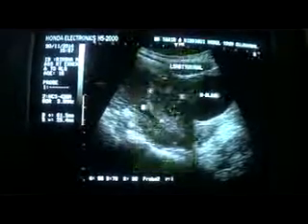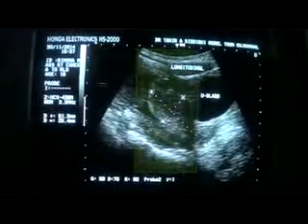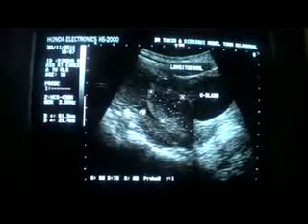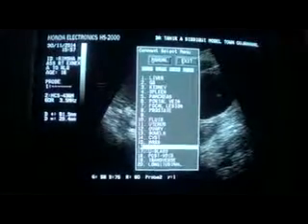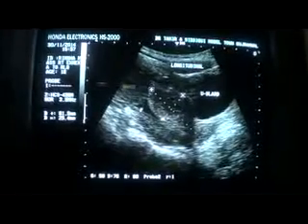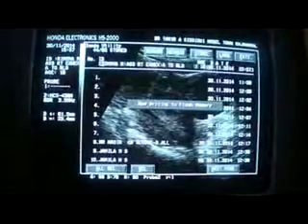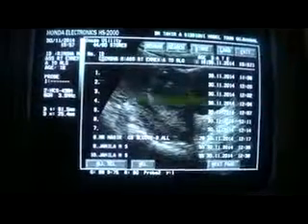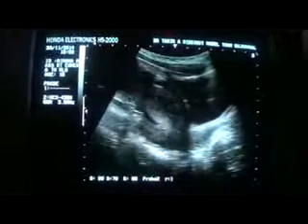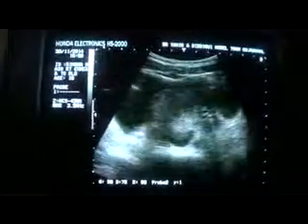And here you see there is small amount of fluid seen in the pelvic cavity. This is fluid, and there is a mass. This is in fact a mass that we will study later on. First, let's see the uterus and concentrate on the uterus to start with.